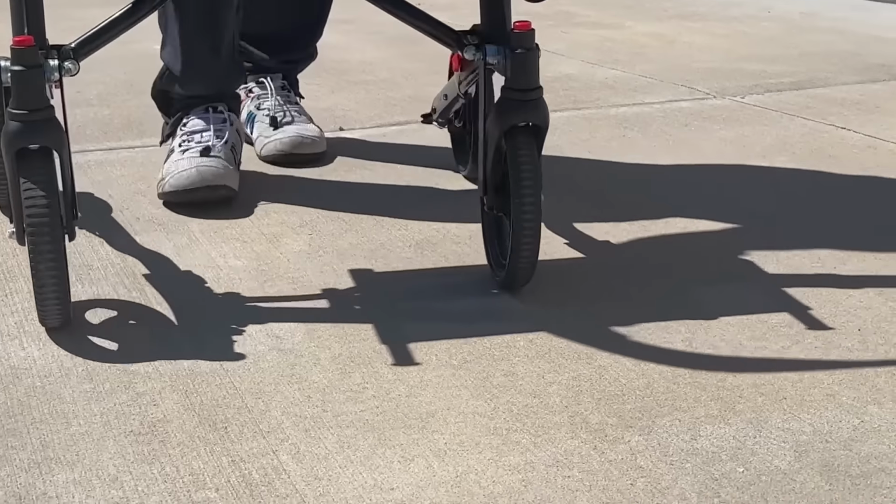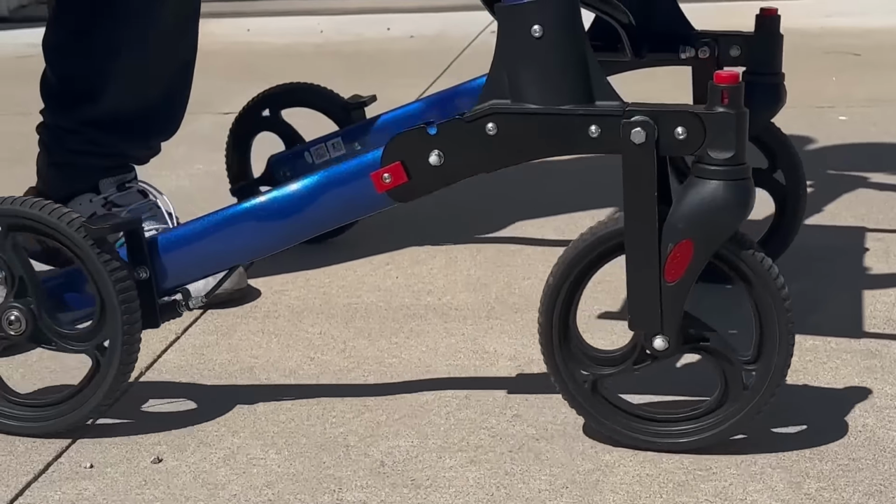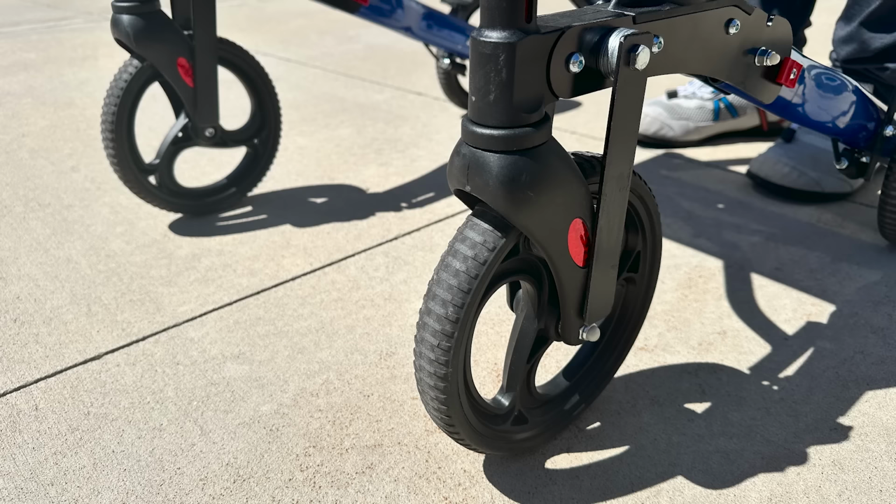So what Bob bought is a four-wheeled walker. It has casters that swivel on the front like almost all of them do, but that was actually causing a problem for his stability. So what I needed to do was create a locking system so the casters could no longer swivel. You'll see on the photograph how I made them. Quite simple, actually. There's washers with a piece of strap steel on both sides. Very basic and elementary as far as fabrication, but it works very well.